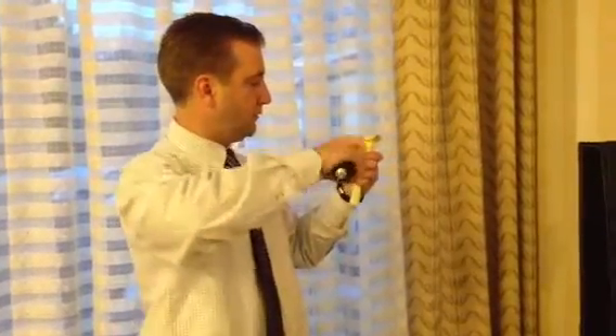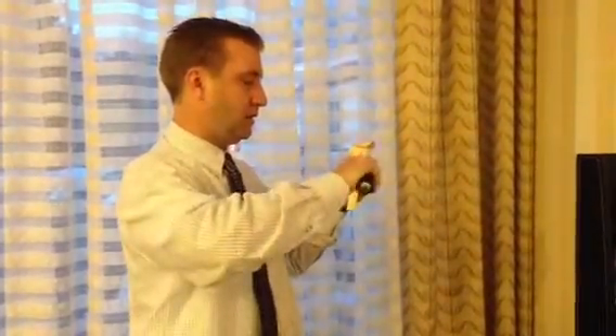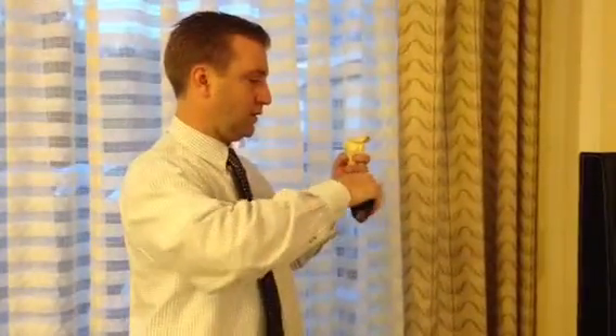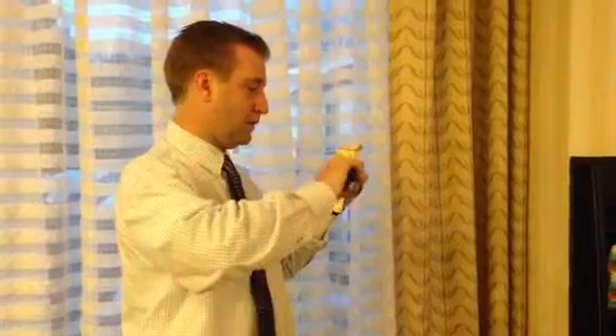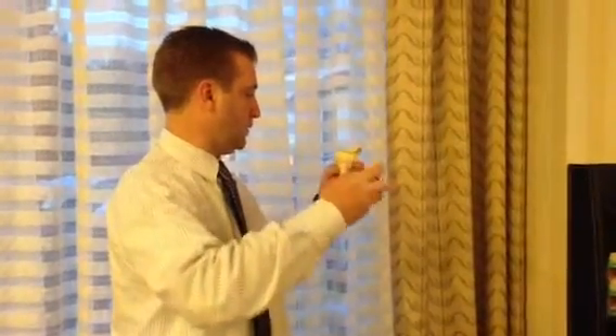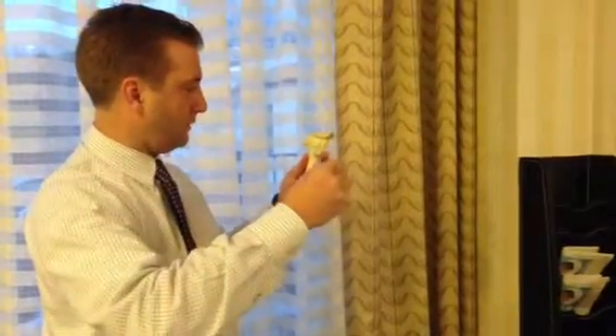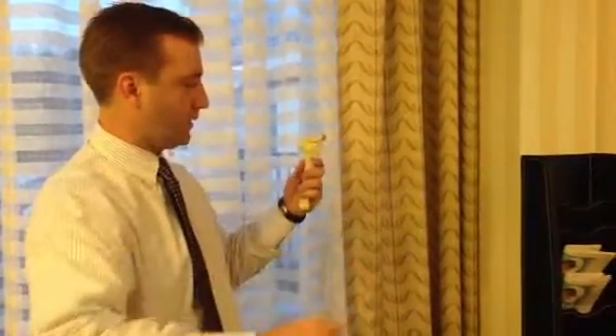And then you just deliver your screw right in there — just like that. Done. Guide wire out.